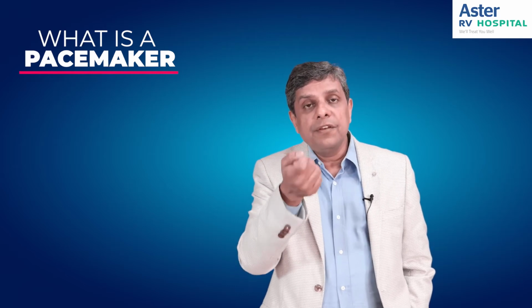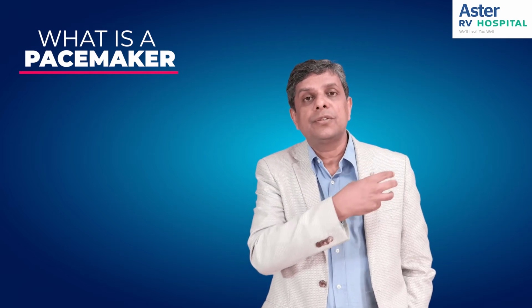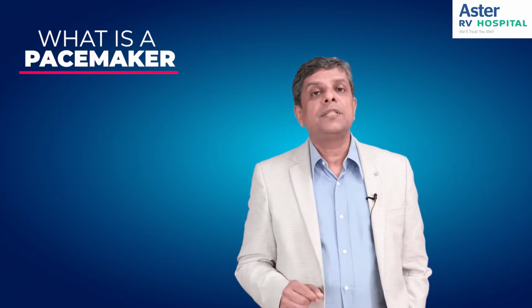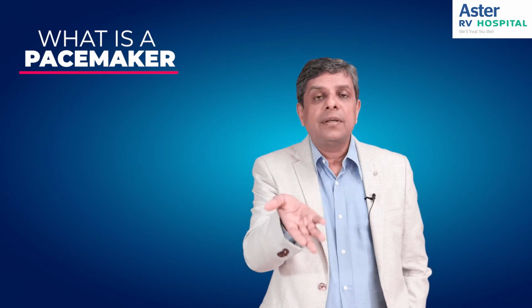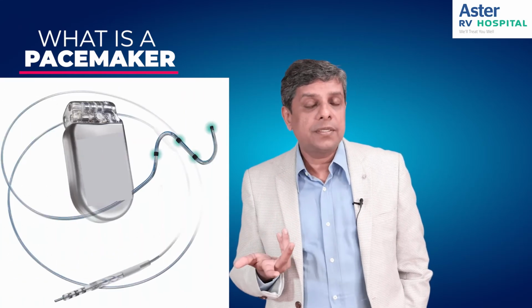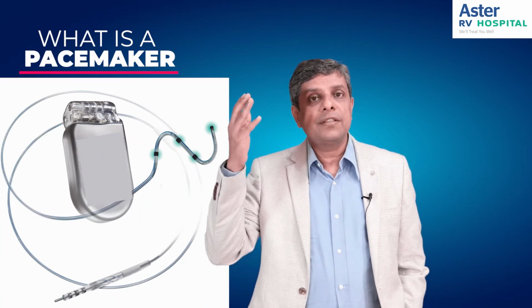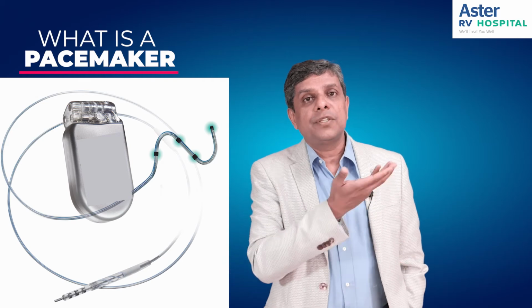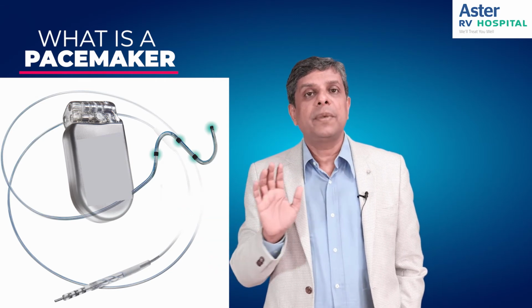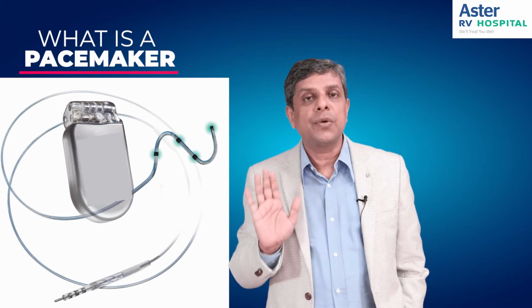It gives the impulse on its own. So it's an automatic device which can detect the times when the pulse becomes slow, and it will give the impulse from its side. So it's like a UPS in your house. If the electricity goes down, the UPS switches on the light. Exactly the same way. If the pulse is normal, the pacemaker sits quietly observing what is going on.